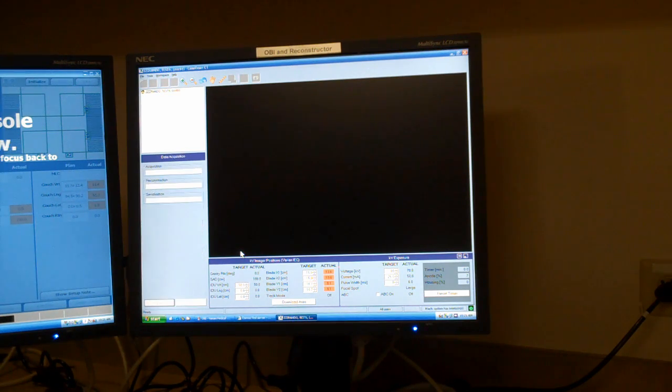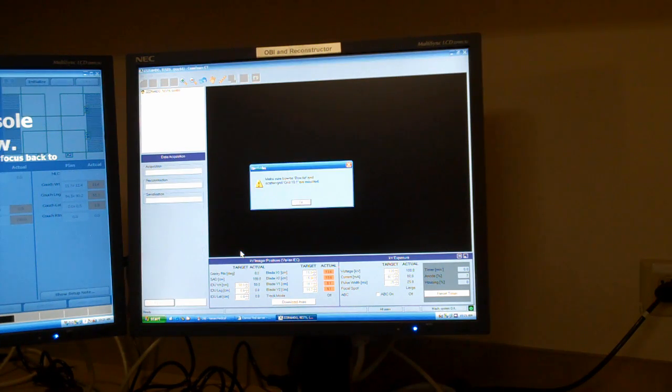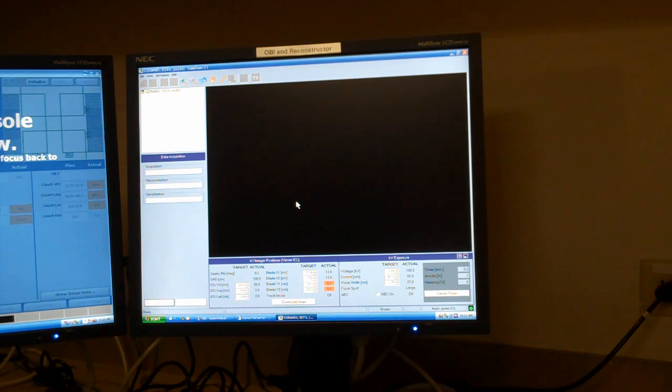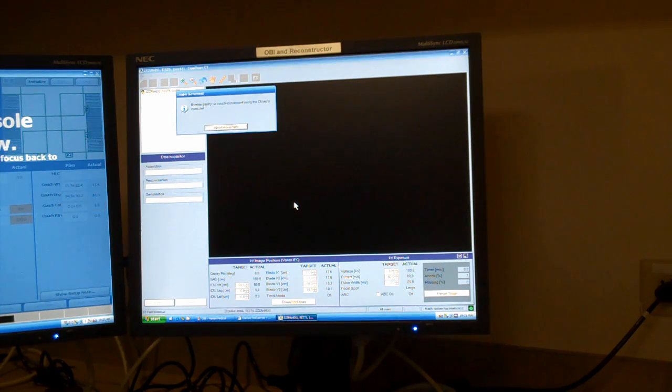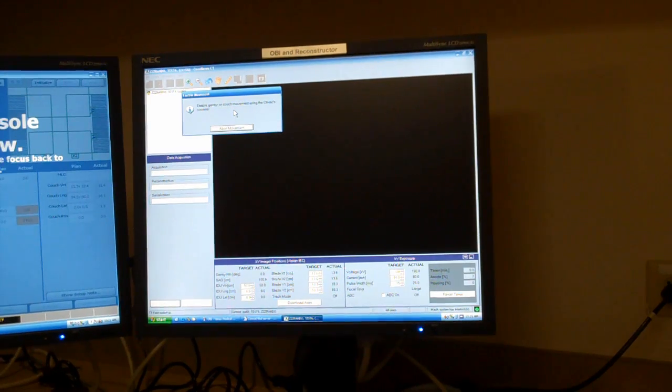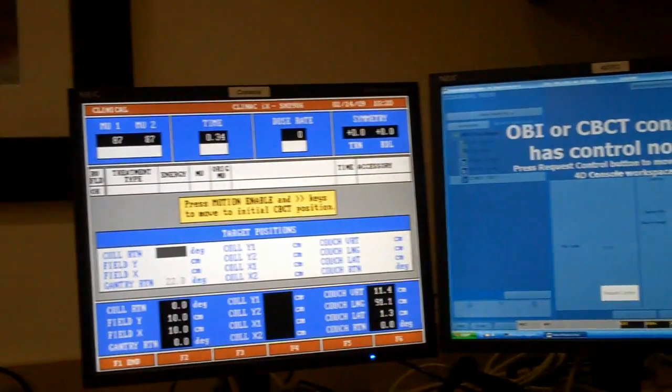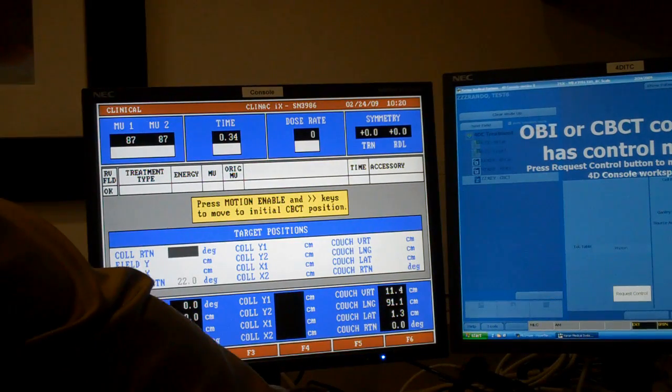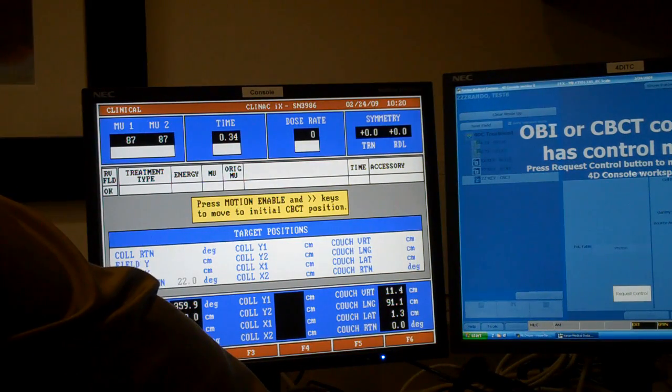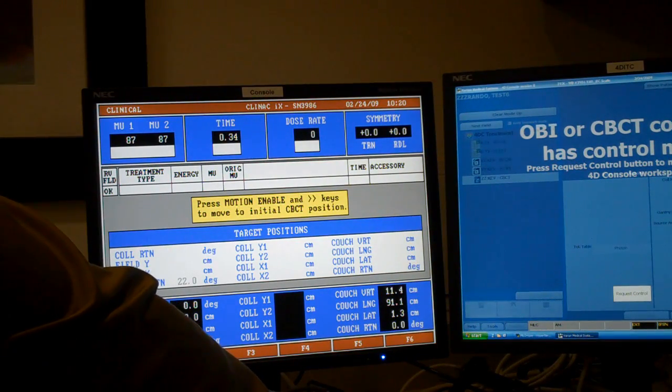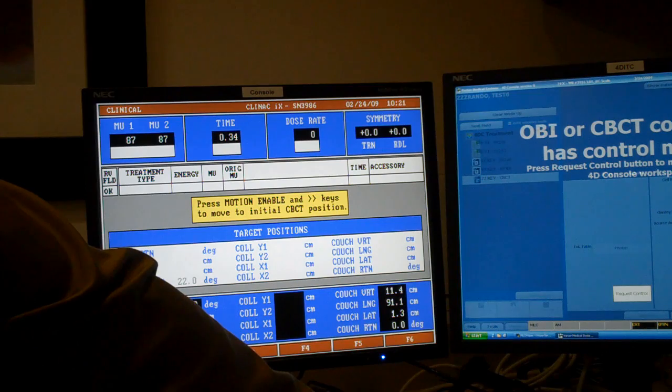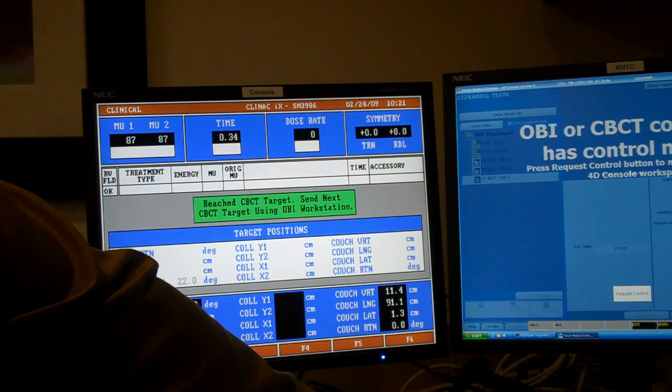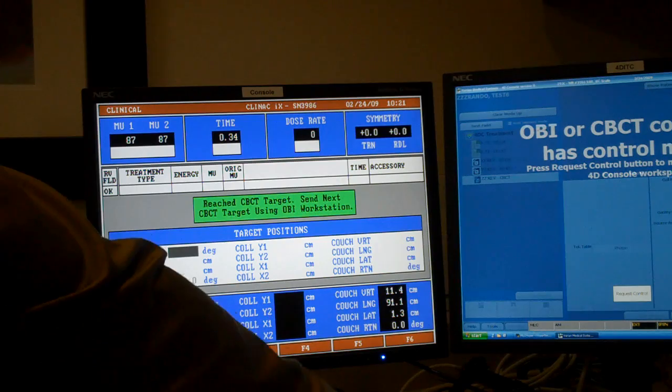Click Start Scan, and it says make sure your full fan is in there, which it is. It says Enable Gantry or Couch Movement Using Clinical Console. That means it wants to move the gantry to the starting position, and so all I do is I hold Motion Enable and go. In this case it's 22 degrees.